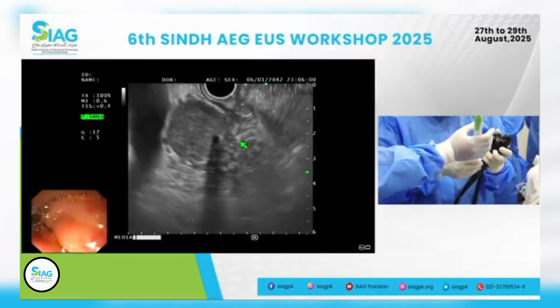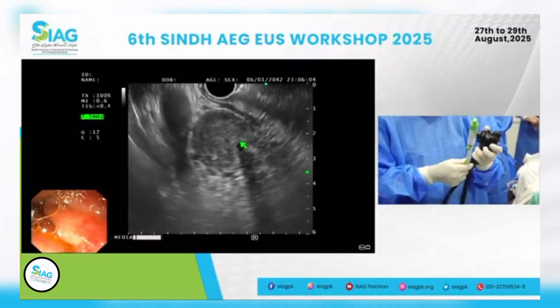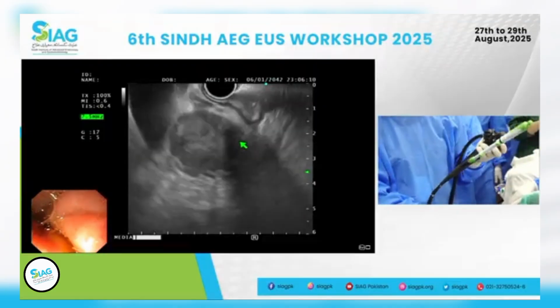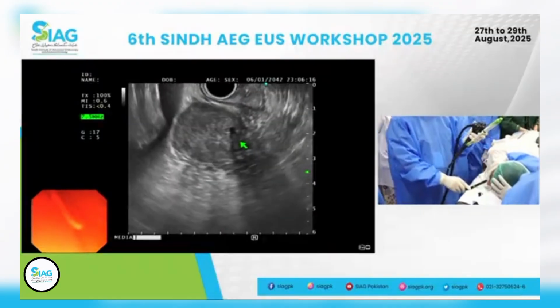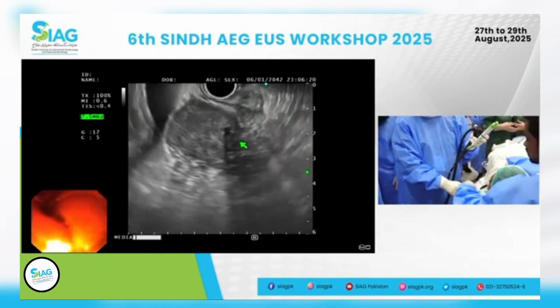Khalid ji, what's your practice for doing FNB? Are you asking me for the needle, or are you asking me how I do it? These are two different questions. Do you do it? Okay. I'm not going to ask about the needle because I kind of know it anyway.